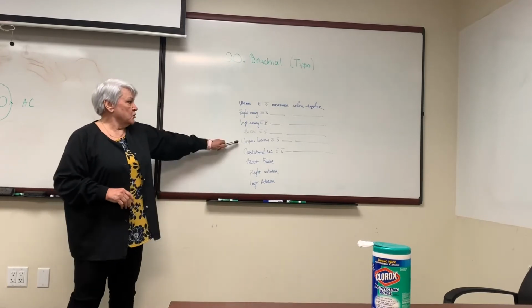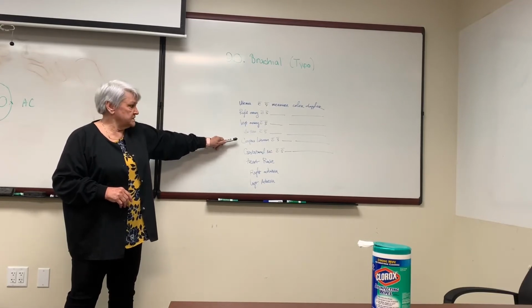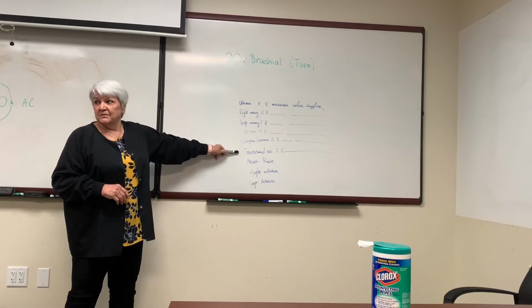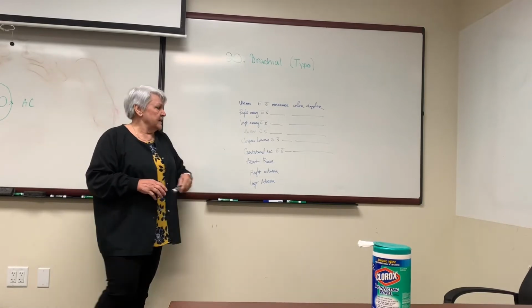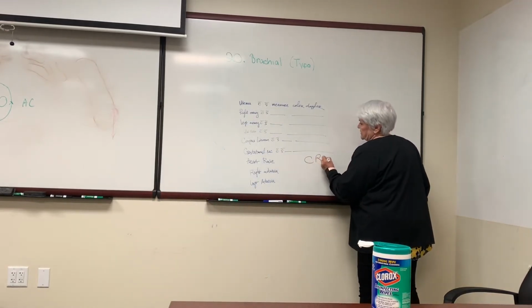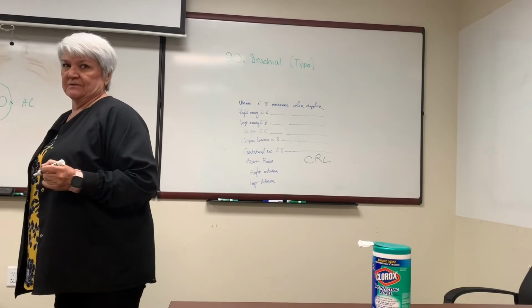Okay? The corpus luteum is going to be on either of the ovaries. That's with and without color, with and without measurements. The gestational sac, with and without color, with and without measurements. The heart rate, the right adnexa, the left adnexa. The only thing he forgot was the crown rump length. Oh. Okay, with and without measurements, with and without color.